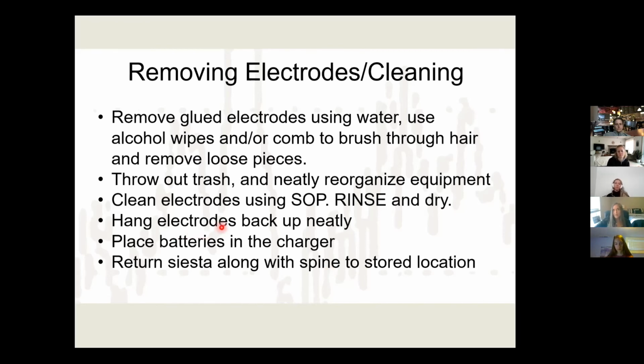Ellen and Sophie and I think we put hooks behind the door in the office space. So you can see a bunch of electrodes hanging on hooks there. Put the batteries back in the chargers, and then return the Siesta to the correct location.